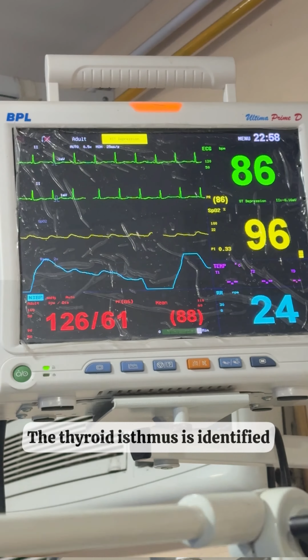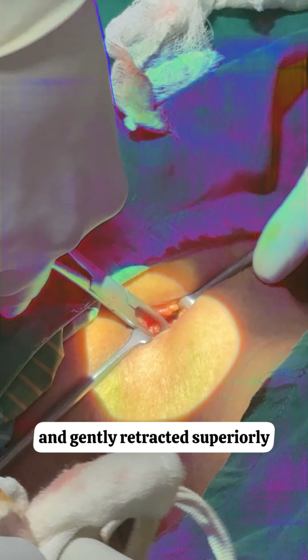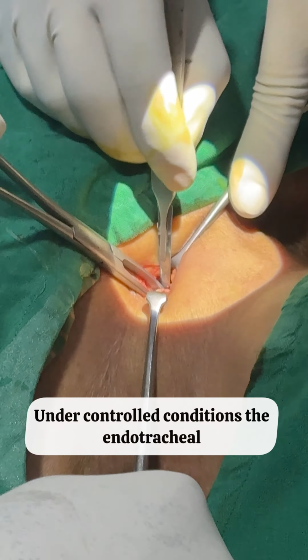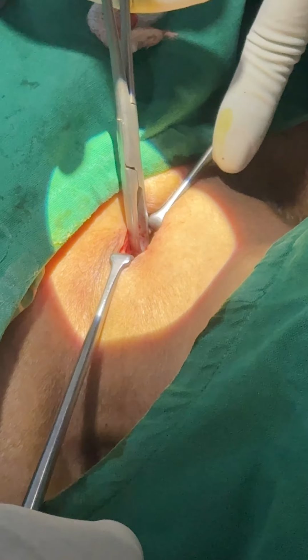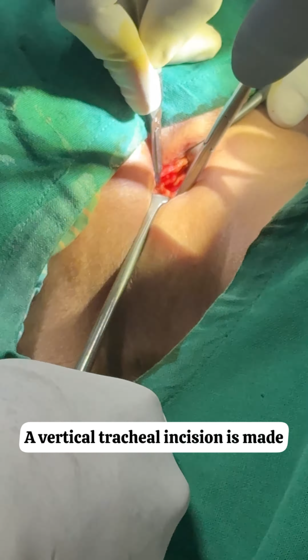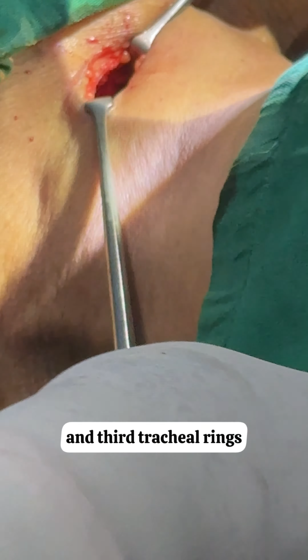structures. The thyroid isthmus is identified and gently retracted superiorly. The tracheal rings are clearly visualized. Under controlled conditions, the endotracheal tube is withdrawn slightly, if present, while maintaining ventilation. A vertical tracheal incision is made between the second and third tracheal rings.